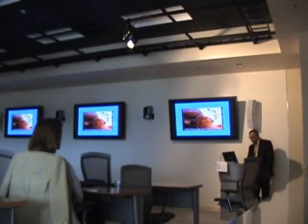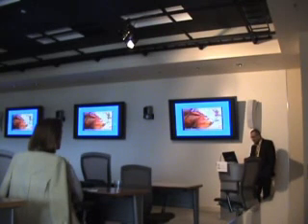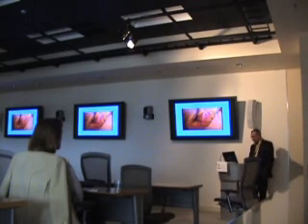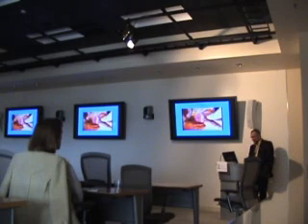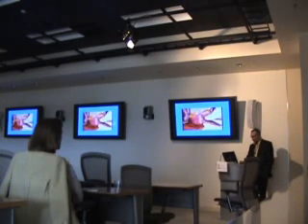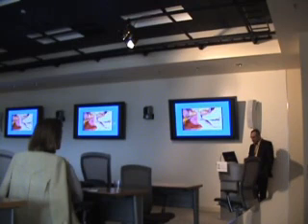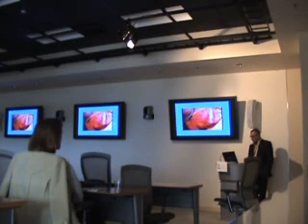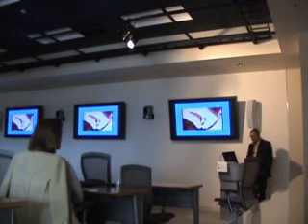Neck dissection, exposing the carotid artery in preparation of endarterectomy. You can see here, while dissecting, the pulsation of the carotid artery. Here, ligating the facial vein. Bleeding happens from the facial vein.